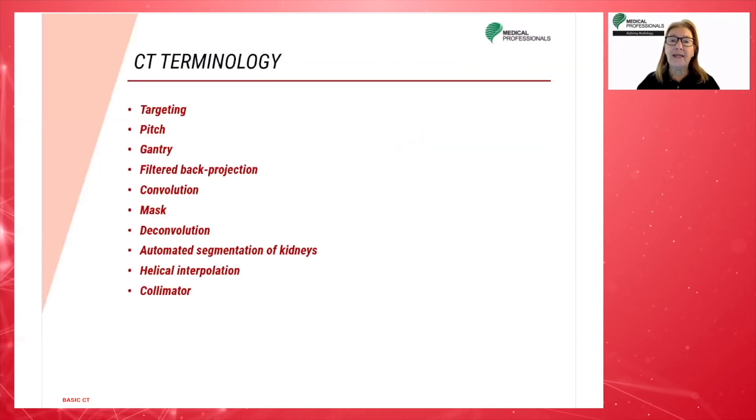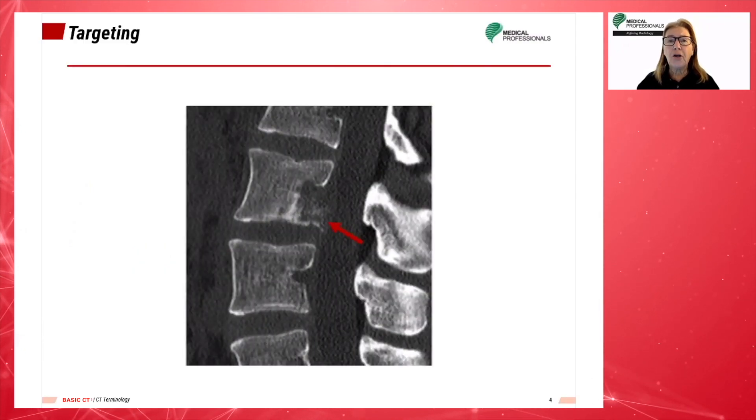We will begin by talking about targeting. Targeting is a magnification technique done through reformatting. The reformatting process reconstructs image data in a smaller pixel size to produce magnification with less distortion. This is done for areas where fine detail is needed, such as in the inner ear. Here you can see the magnified fracture in the lumbar spine.